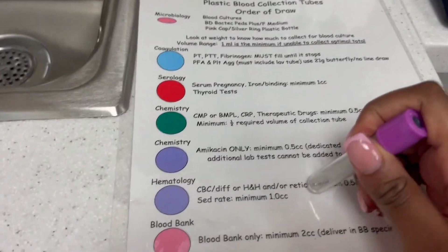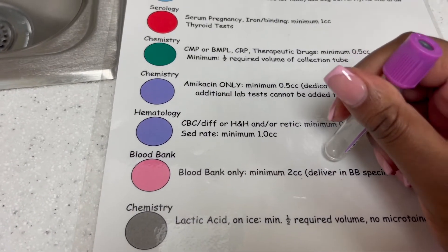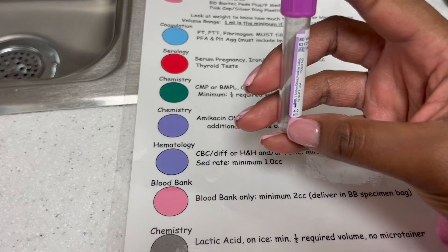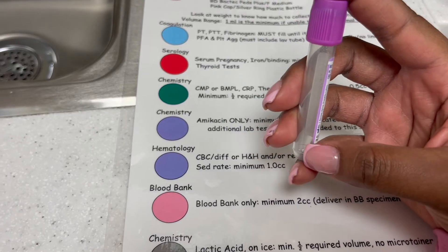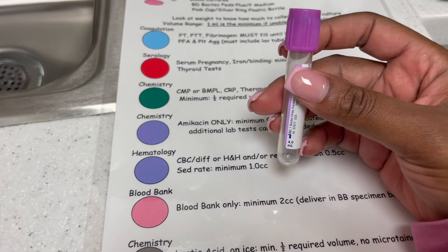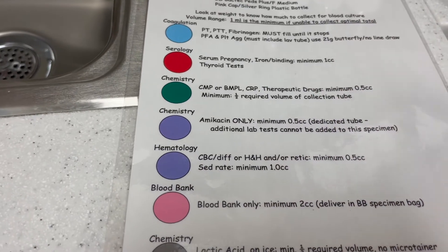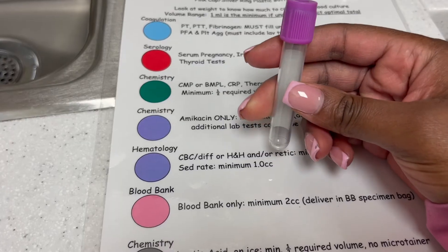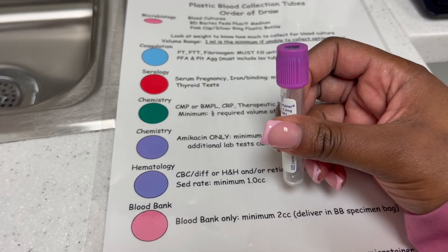Next we have hematology — CBC, H&H, and things like that. For a CBC with Diff, you don't have to fill the whole tube. They really just need it filled to where the label is. So if you ever have a CBC that's a little short, just fill it and send it. The worst they can do is reject it and ask for a redraw. You don't need much for a CBC.